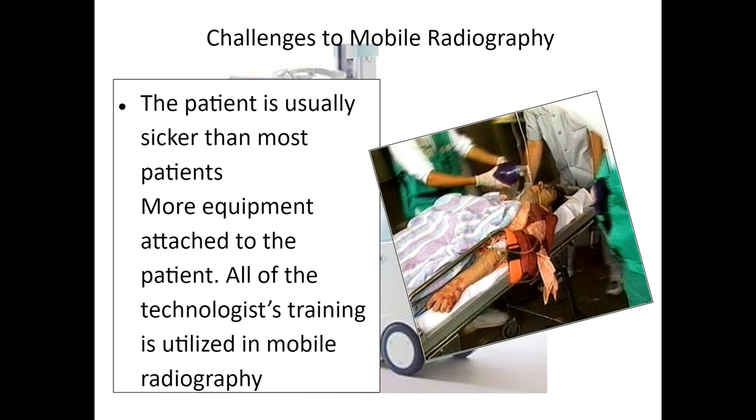One of the things that you need to be aware of is making sure that you prep everything, right? Don't yell x-ray and then position. Get the plate under the patient, have your technique all set, basically ready to expose, then you say x-ray, right?